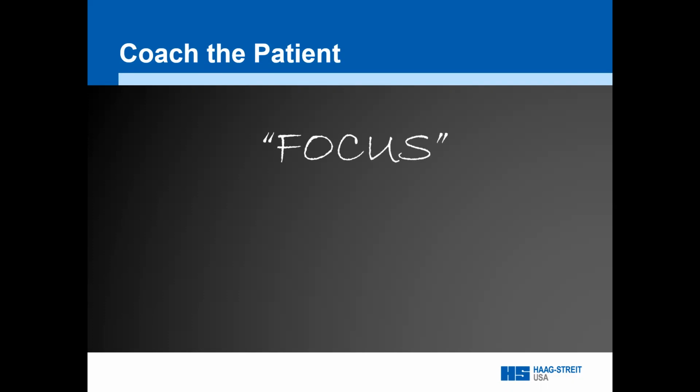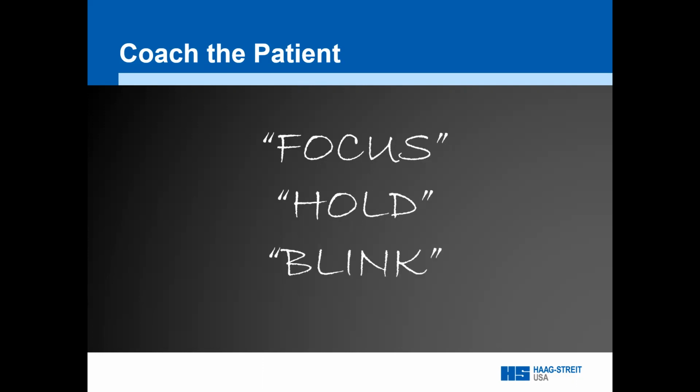Then, when each measurement is about to complete, I'll ask the patient to hold for the flash. I like to refrain from saying don't blink, because the last word that they hear is blink, and that's usually what they'll do instead. Lastly, I'll advise the patient to go ahead and blink after the flash is over, so they're replenishing their tear film for the next scan.